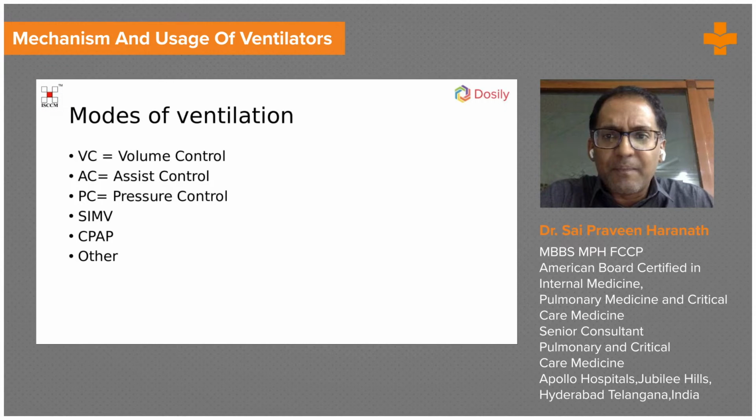The modes of ventilation, these are the abbreviations we'll be using: volume control, assist control, pressure control, synchronized intermittent mandatory ventilation, continuous CPAP, which is continuous positive airway pressure, and there are many other modes.